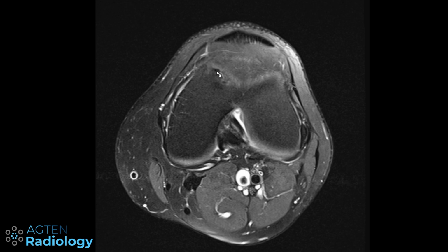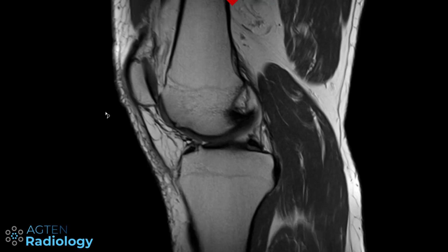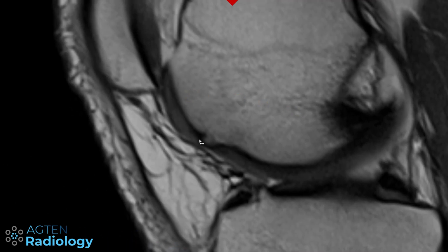But always make sure that you're not dealing with an intracartilaginous osteophyte. So take your second plane, and you can see here nicely that in this case, this is actually an osteophyte within the cartilage. You can see this on knee MRIs, it's not so frequent, but make sure that you don't read this as a cartilage defect. So this is one of the differential diagnoses, but typically they are more at the condyles and not so much in the trough of the trochlea.